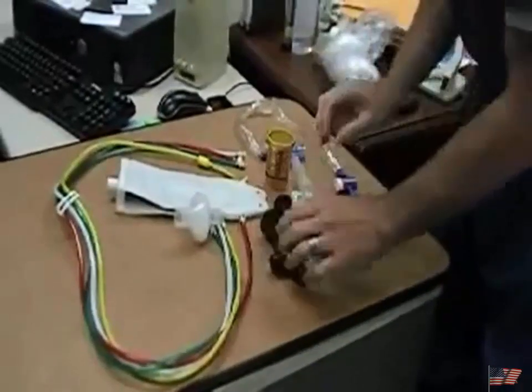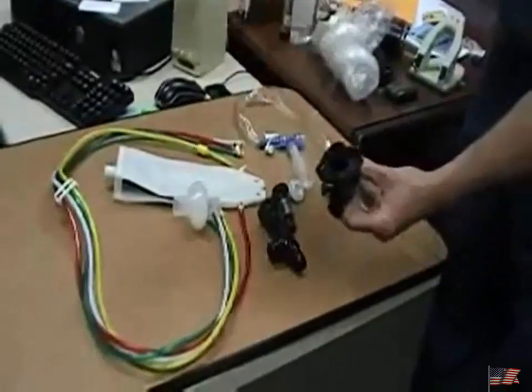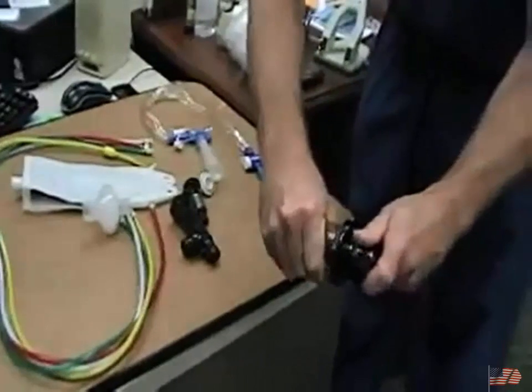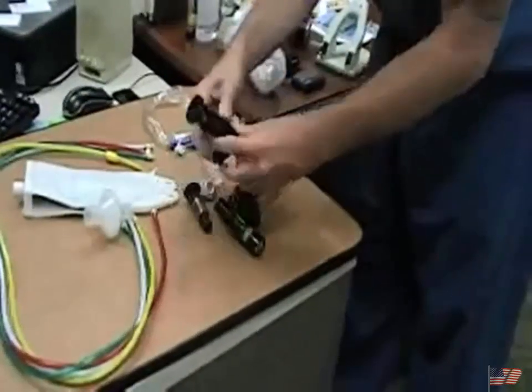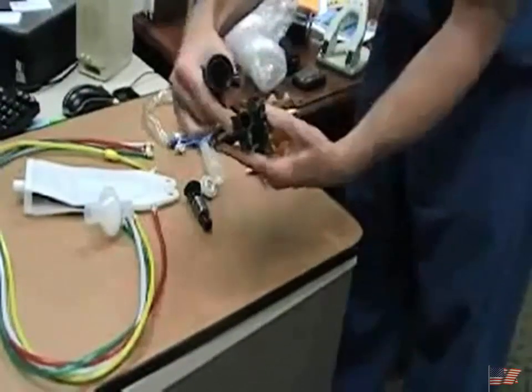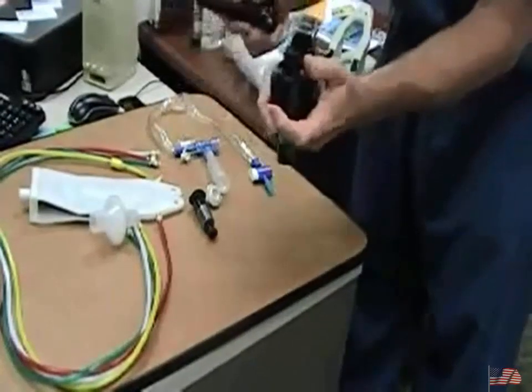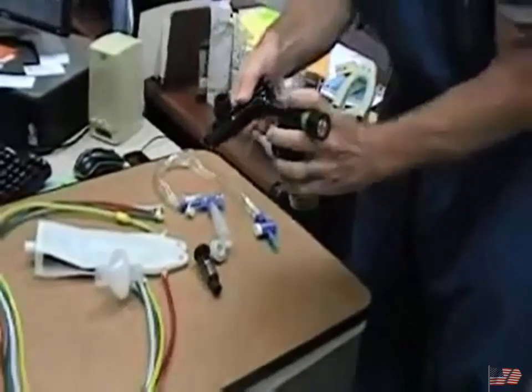Okay, now, first thing, here's your nebulizer cup. Just fits in here and then it locks in place. Alright, so it's got a good snug fit to it. Now this is kind of green and so is that, so those two match up. And if you really think about it, there's nowhere else for it to go, which is nice.